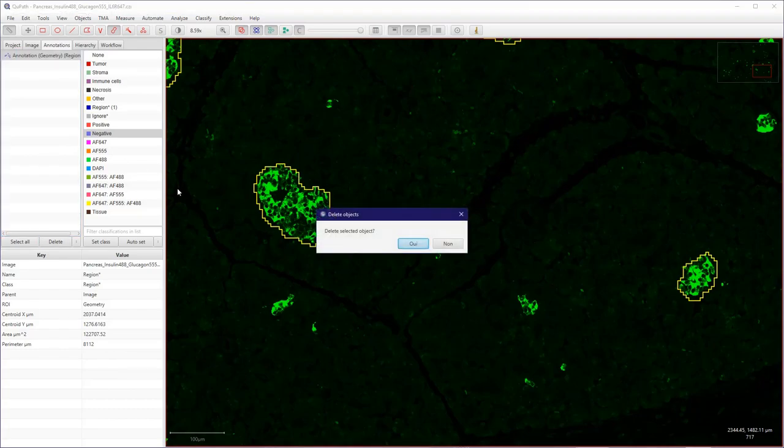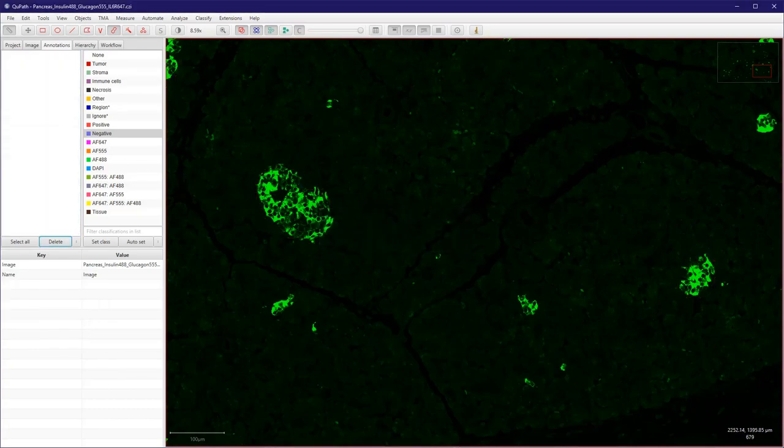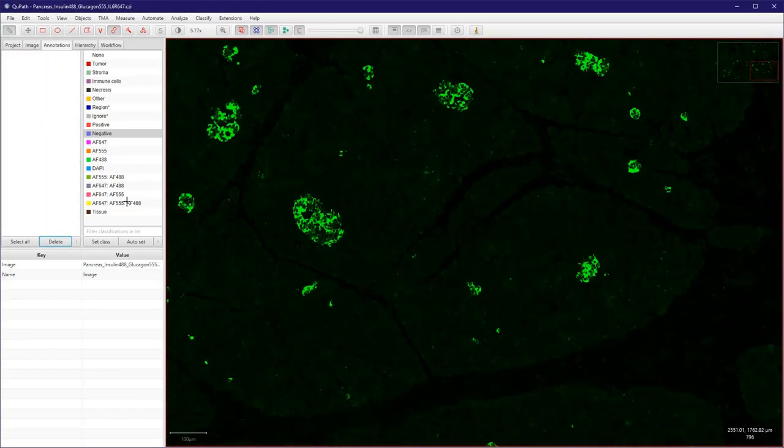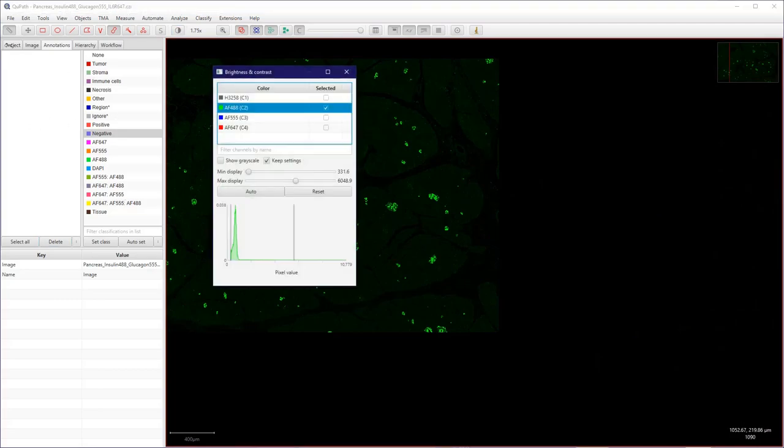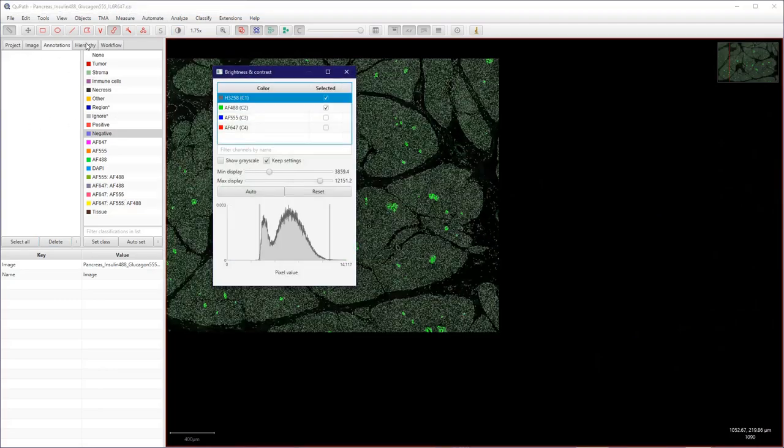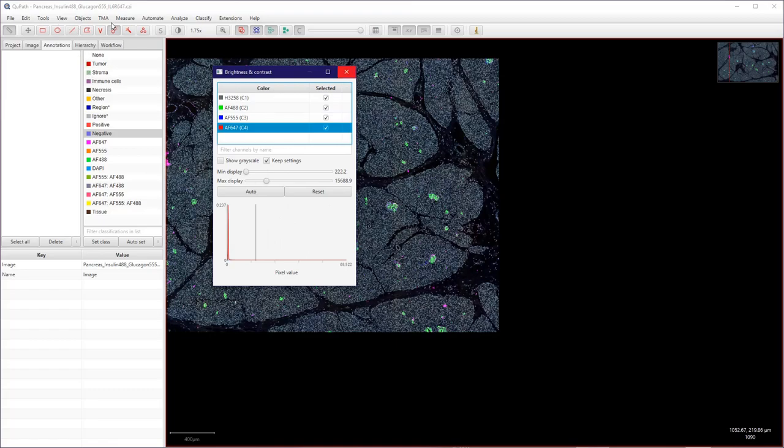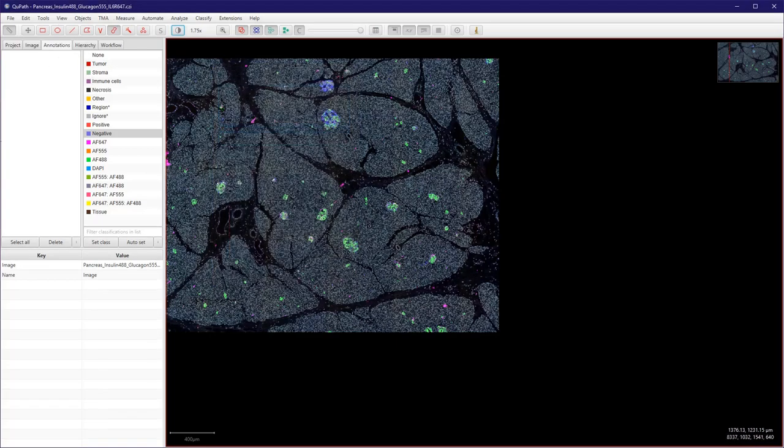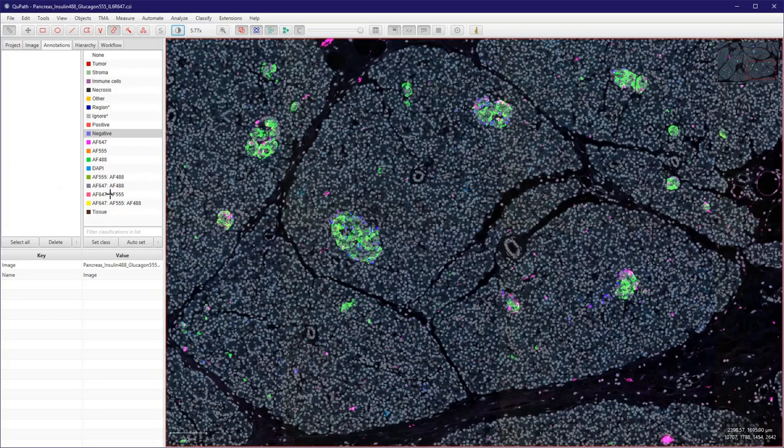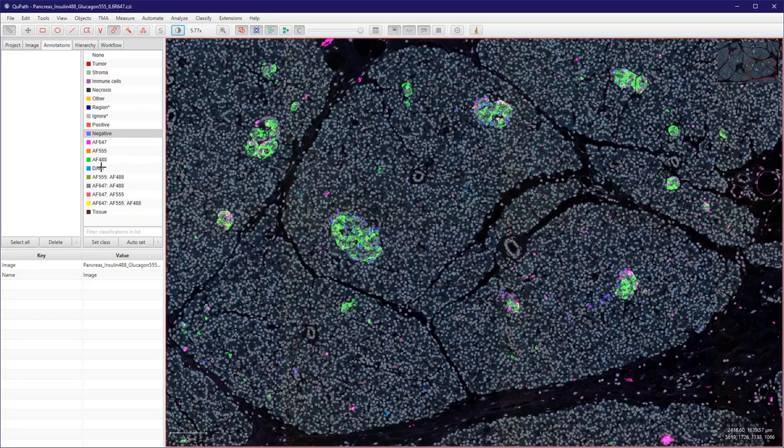So I will clear up here my annotations and I'm just left now with a fluorescent image. So I wanted to select those green regions here.